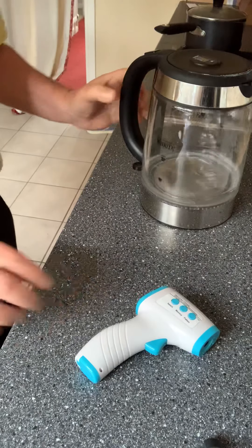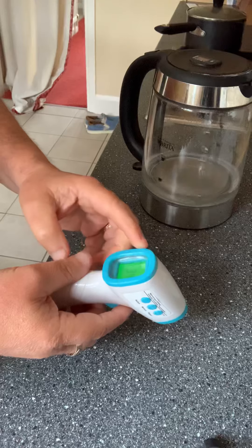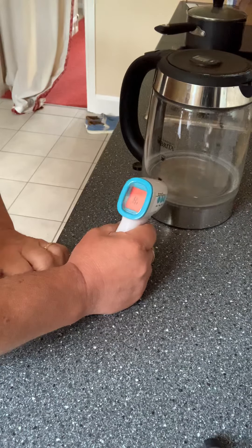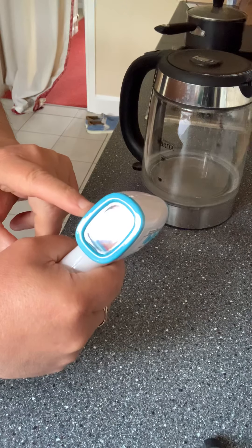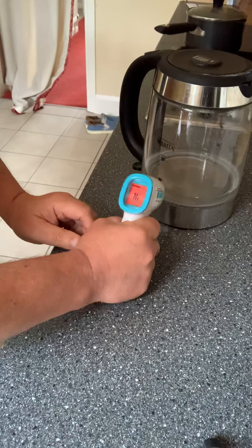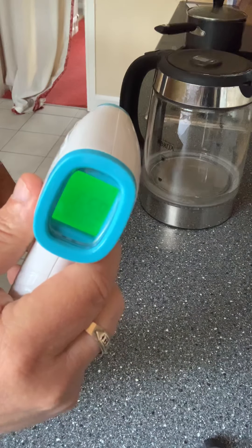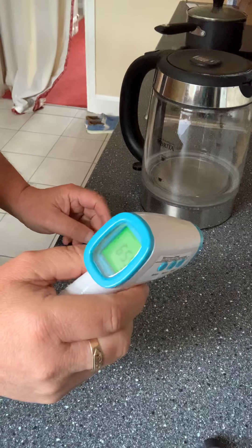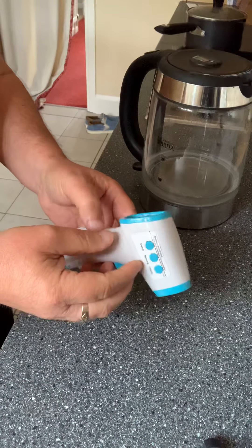If I test it on the kettle — just touch it to get it working — while it's on body mode and press it on the kettle, it tells you straight away that you've got a high temperature. But if I change that to surface mode, it tells me 65.9, and I've just warmed the kettle up a little bit. Very impressed.